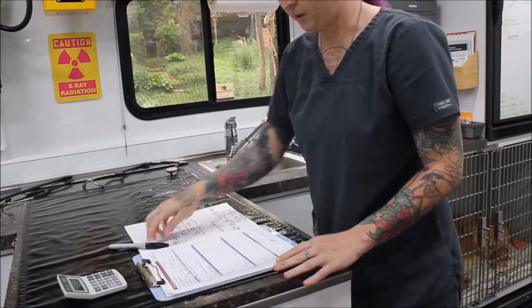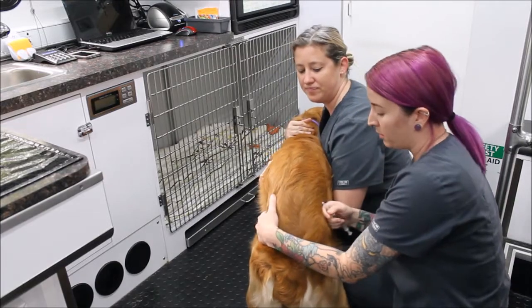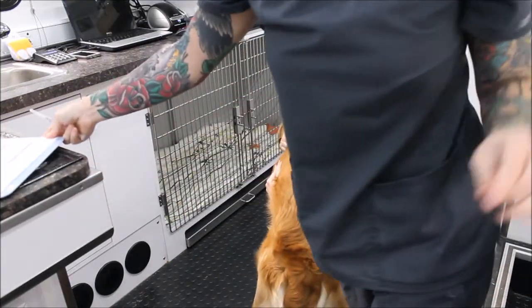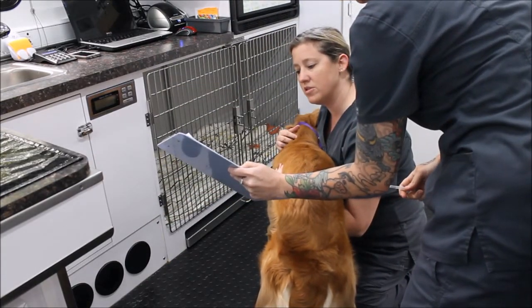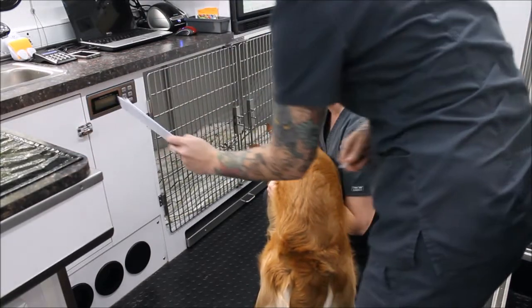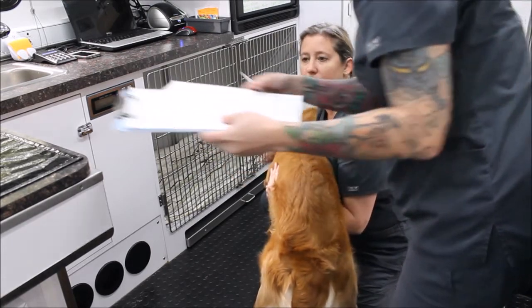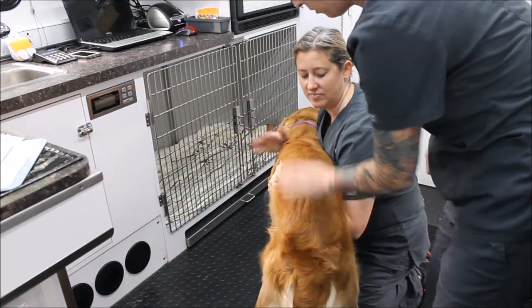Now I'll go ahead and get those drawn up, then we'll give him his IM injection. Now that I've drawn up my drugs, I'm confirming with the doctor that this is the correct dose. She double-checks: butorphanol at 0.2 mg/kg ends up giving 0.58 mL — that's right. And the propofol at 4 mg/kg gives 11.6 mL — confirmed correct by the doctor.